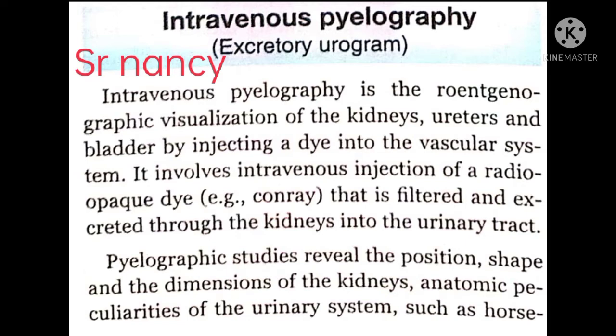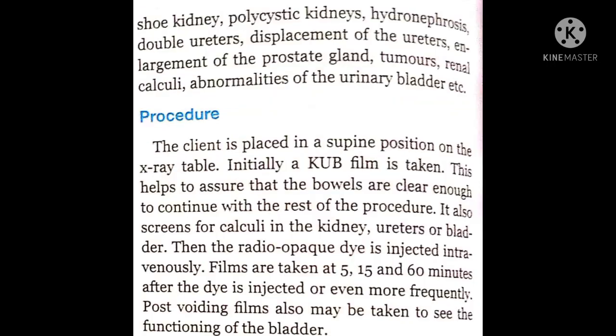Pyelographic studies reveal the position, shape, and dimensions of the kidneys, and anatomic peculiarities of the urinary system, such as horseshoe kidney, polycystic kidneys, hydronephrosis, double ureters, displacement of the ureters, enlargement of the prostate gland, tumors, renal calculi, abnormalities of the urinary bladder, etc.